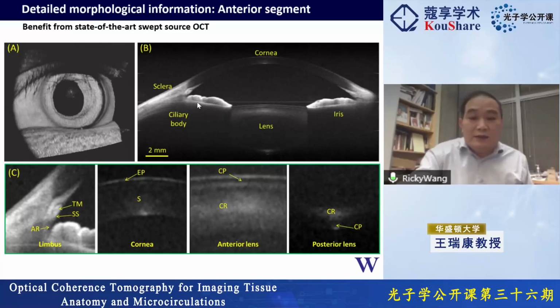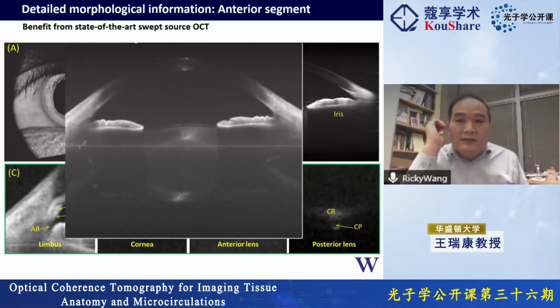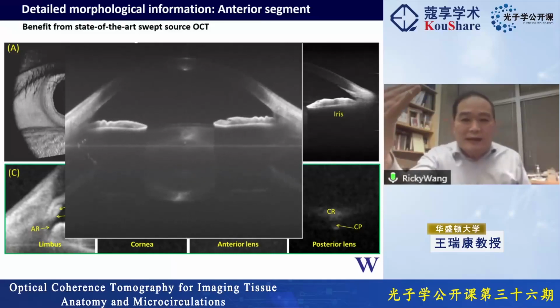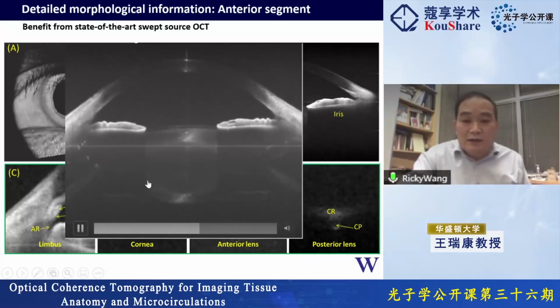Okay, and this is an example of looking at how active your iris is when a flashing light in front of you is flashing. So in this case, you can look at the dynamics of the iris, and of course, you can look at the lens dynamics as well.